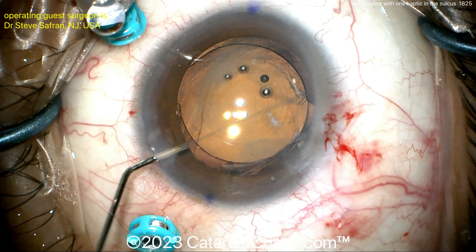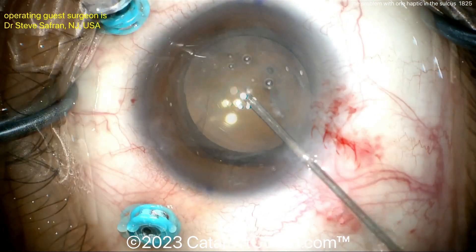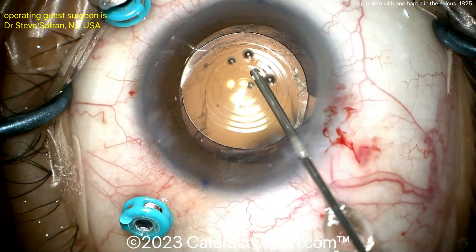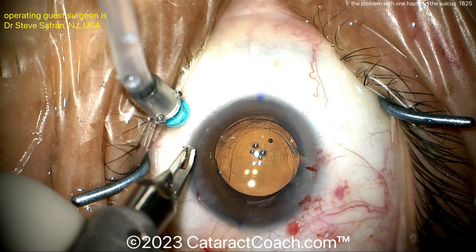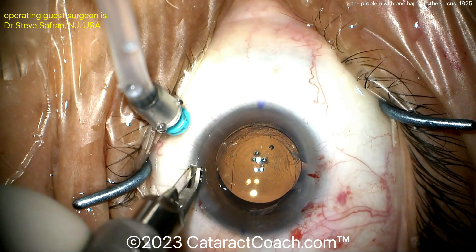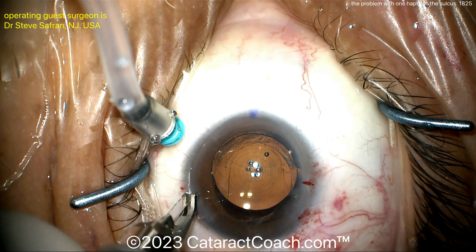You see at the end here, it looks pretty darn good. Triamcinolone is going inside the anterior chamber to make sure there's no prolapsed vitreous — looks pretty clean. And the patient can have a really nice outcome. The lens is very stable and beautifully centered now. And then here at the end, it looks like limbal relaxing incisions in order to help cut down any pre-existing astigmatism and give the patient a better visual outcome.